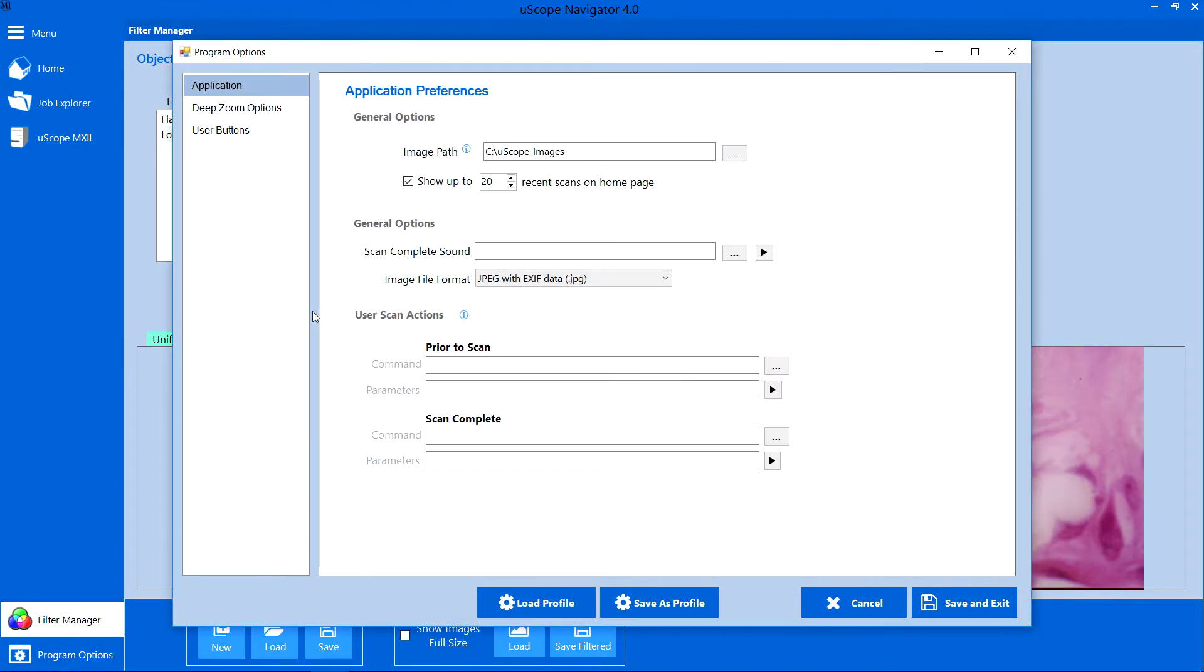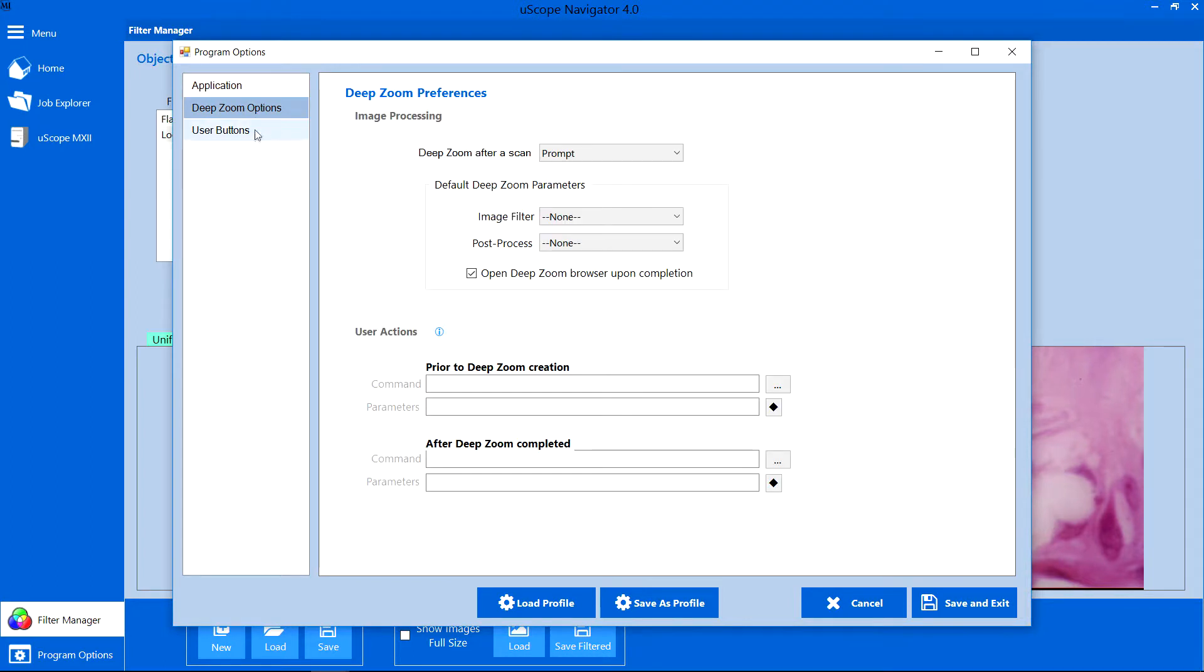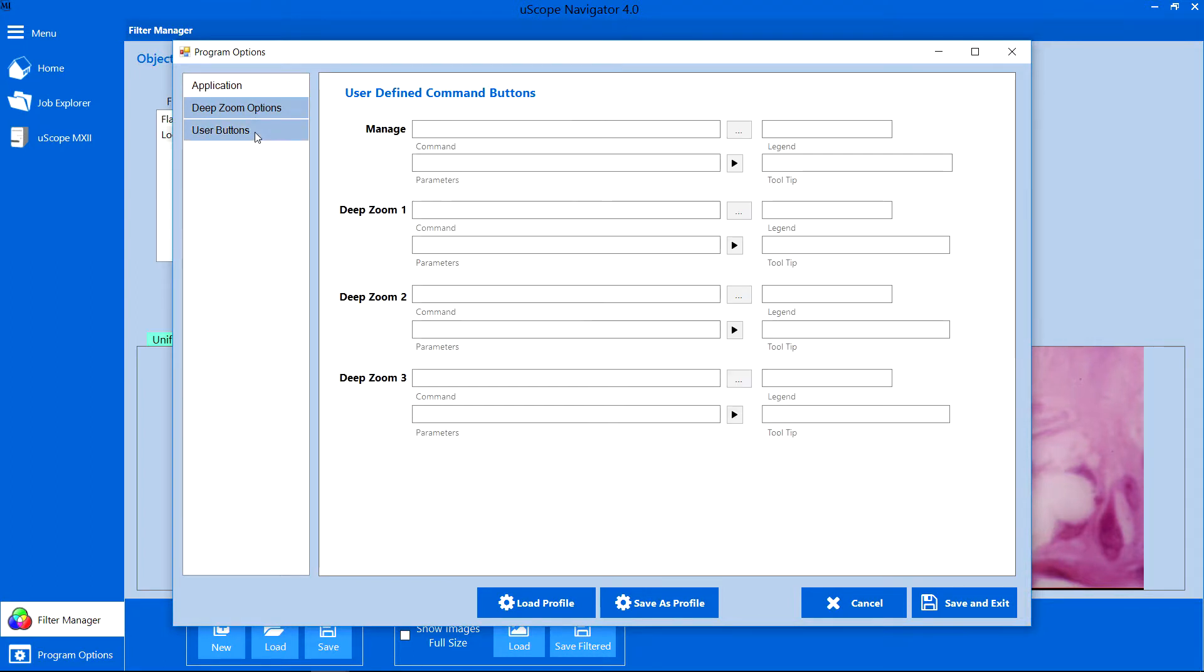The Program Options tab opens the Application Options dialog, where you configure application preferences, deep zoom options, and user configured buttons.